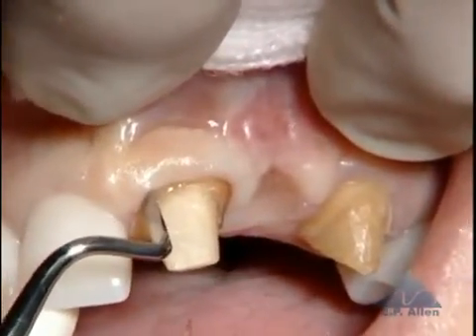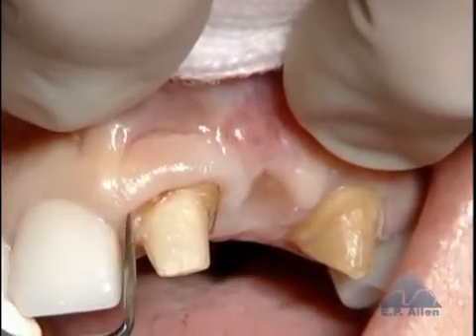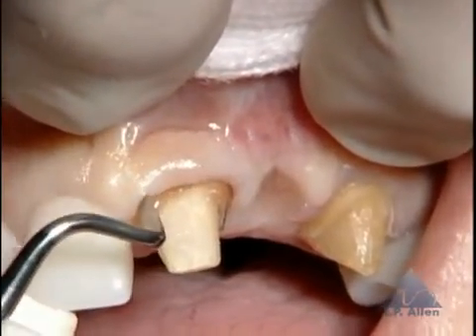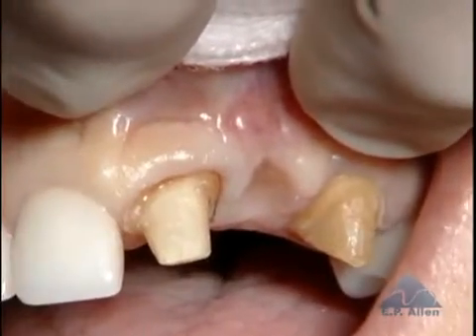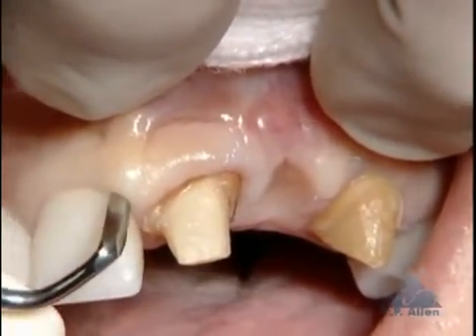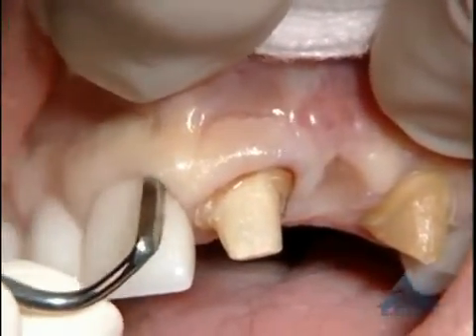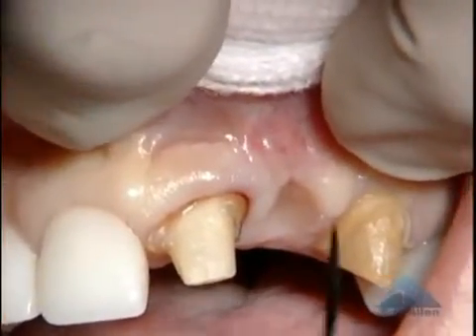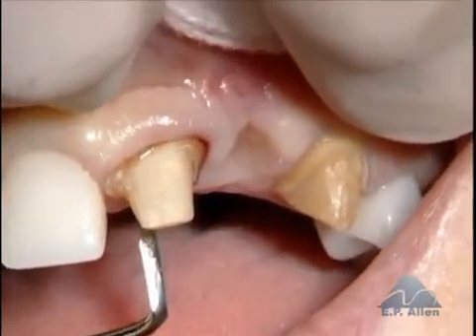So we continue this around the central into the proximal site, and there's a very narrow papilla here, so we want to be really cautious in this region, but I want to come completely around the central and actually go into the sulcus of the adjacent central to help mobilize the papilla between the central incisors. I'll continue on the palatal aspect of the central. See that nicely. Staying within the sulcus.